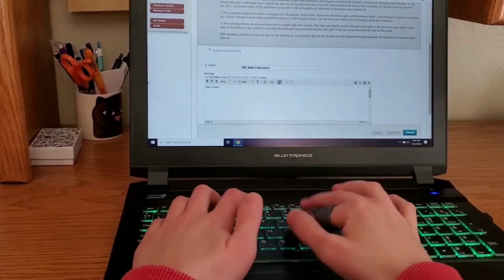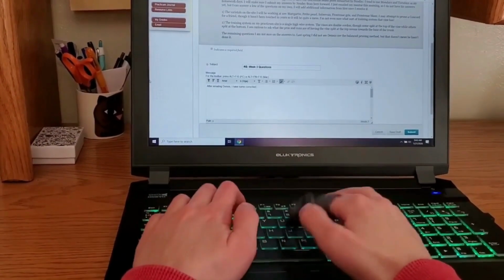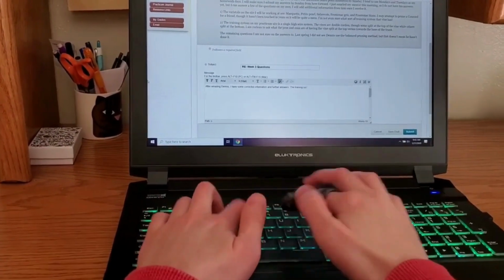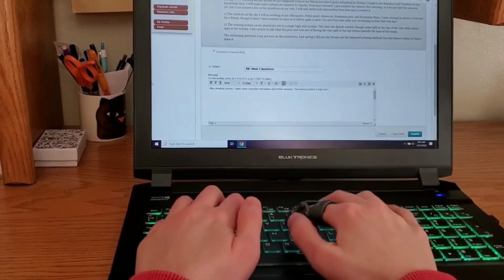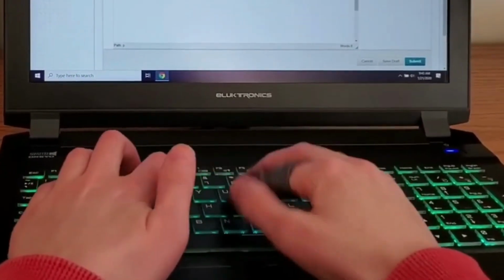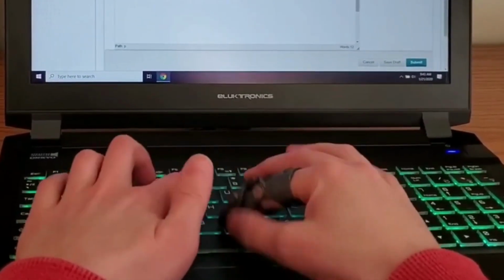So as you can see, what she's doing here with the PIP drivers is using them for typing. It looks like one of those devices does not articulate. I'm thinking that one doesn't articulate, but maybe it does. She's going pretty fast. You can do it with either one for typing. If your device did not articulate, you can use the one that does not articulate, because you would just be using your MCP joint then.